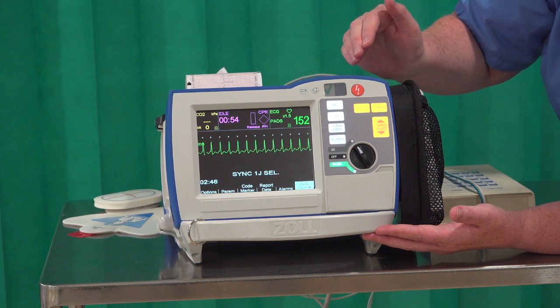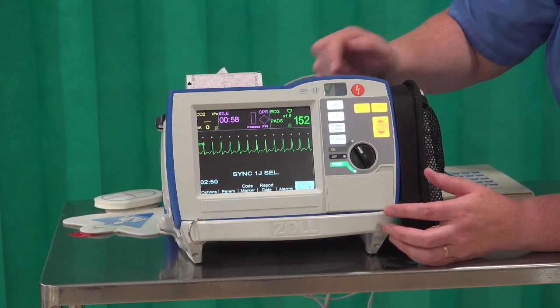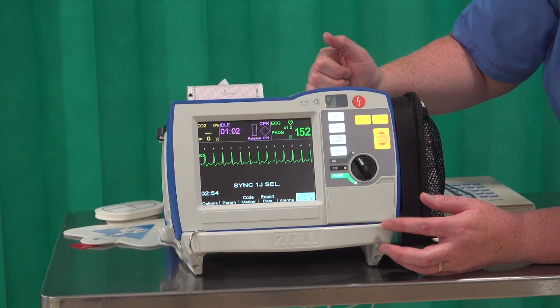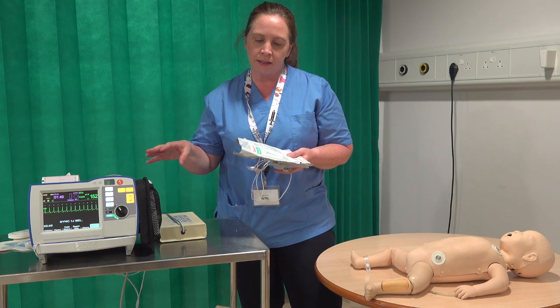The default position is that sync will stay on at all times. If this baby or child goes into arrest, then just make sure you deactivate that sync. So we've spoken about using the defib with adult pads.